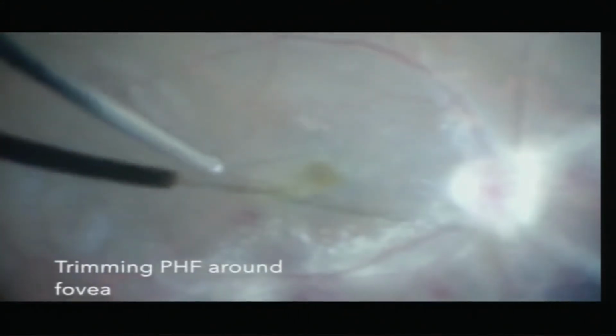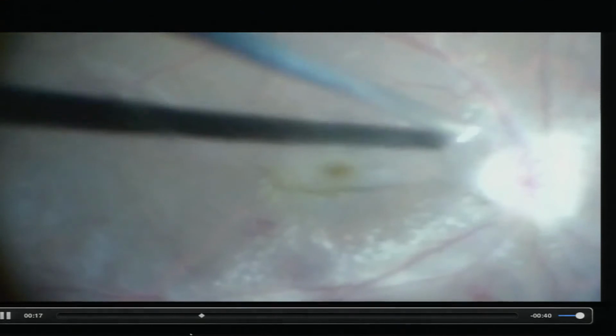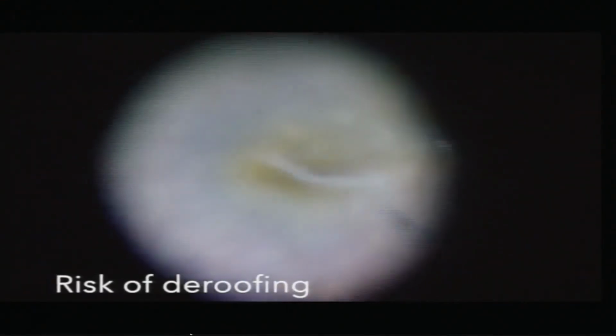So this is a case where we are trying to cut the peripheral posterior hyaloid face, trying to just leave a cuff of vitreous which is attached to the central foveal area. And we are trying to peel off, but we feel that there can be a hole.